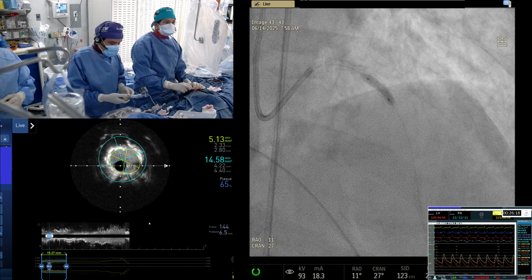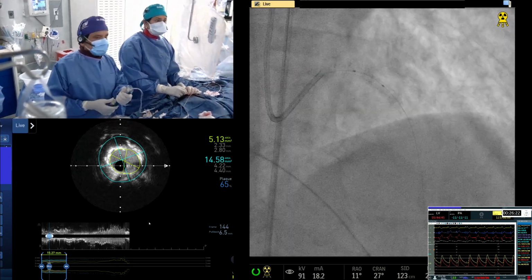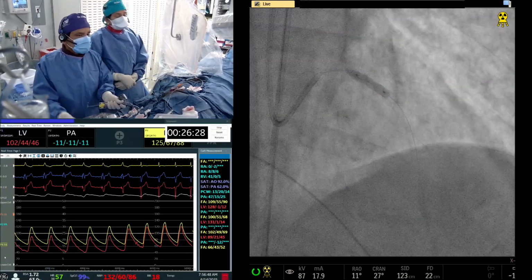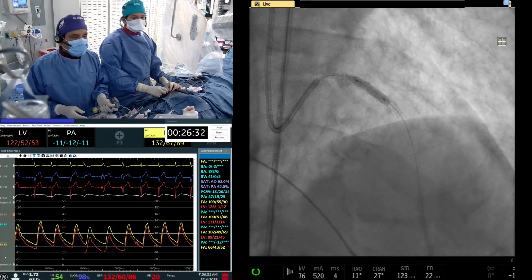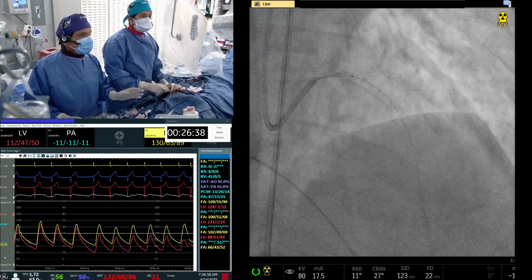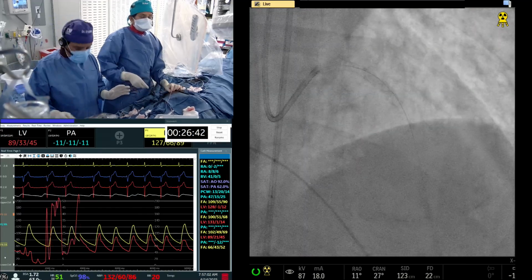Cut down the pacemaker rate to 40. Okay. Go up here. Now we are good. See, the pressure comes up when the pacemaker goes down. Pace rhythm. There's no atrial kick anyway in this case, but somehow it's dependent on that. Patient is okay? Good. Done?